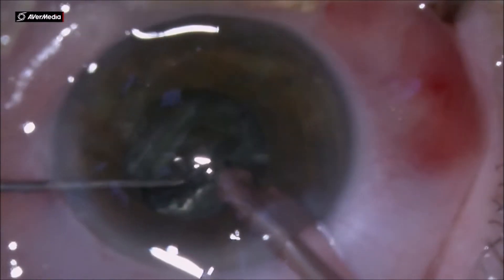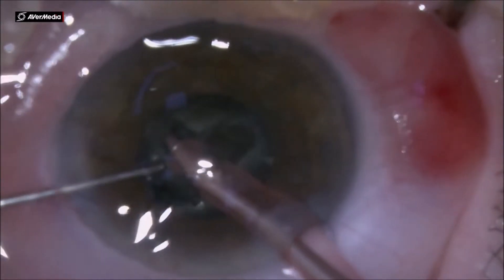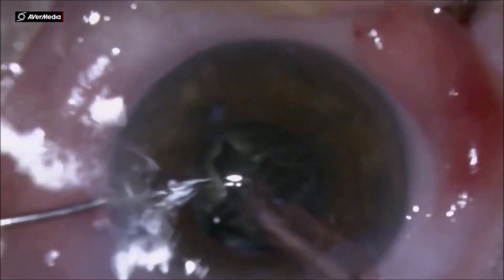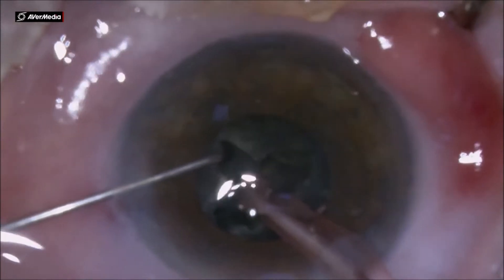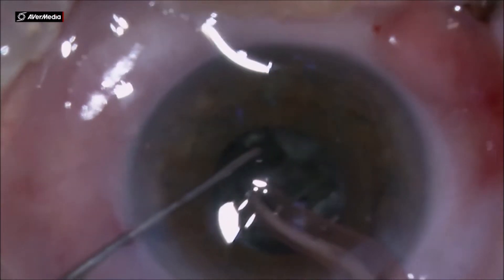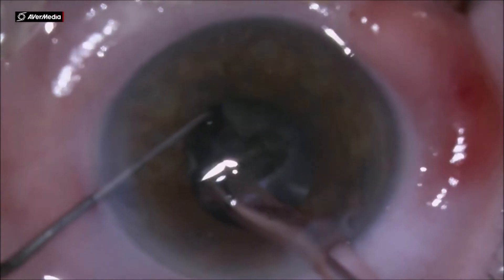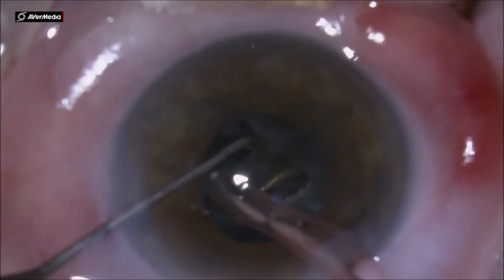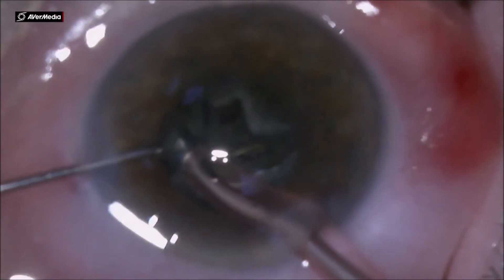Notice that when I am separating the pieces, I am not only going laterally but a little bit one chopper going low and the other — the phaco needle — going upwards, sliding a little bit. And in this T-shaped trench I do what I call the X push.